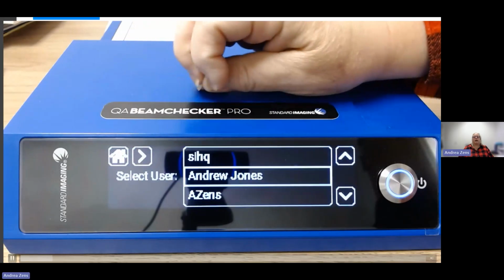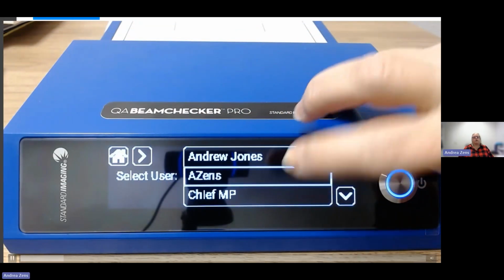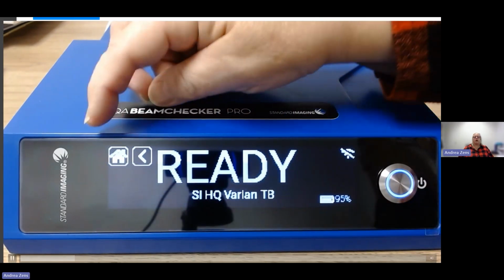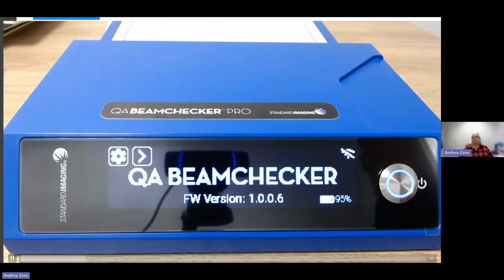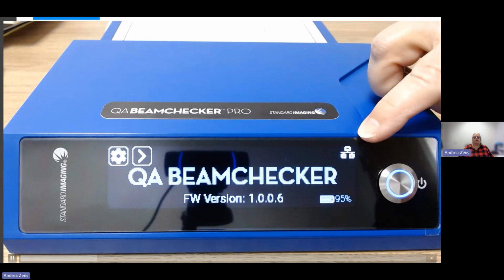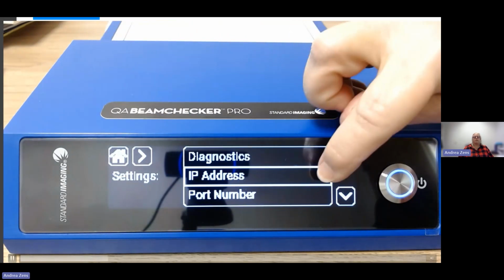We are not connected to anything. We're going to the standalone mode. We've chosen a user. We choose a LINAC and we're set to go. Then they tap on the home screen to go back, and I'm going to plug in. You'll see, plug in an Ethernet cable and you'll see the symbol change to the Ethernet sign. And then we're going to go into the gear to show you what we have available.